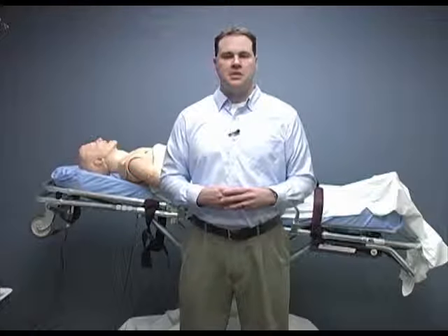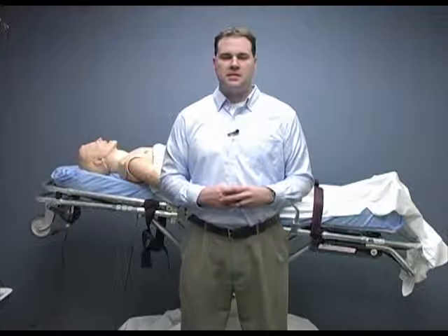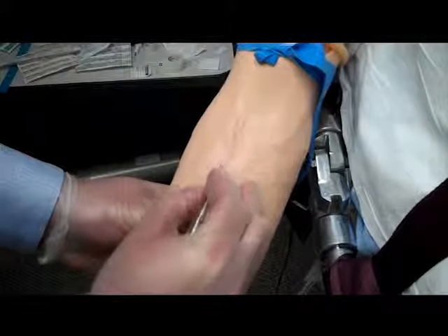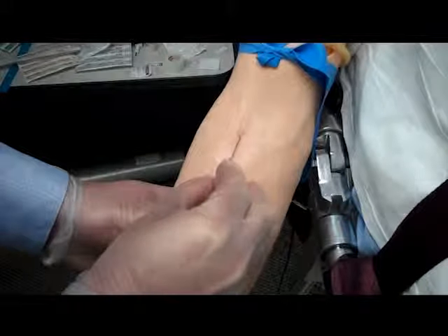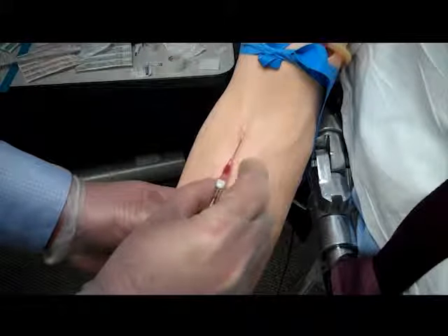We have prepared our patient and equipment. Now it is time to perform the actual venipuncture. You want to pull the skin around the puncture site taut with your non-dominant hand. Grasp the IV catheter by the body with your thumb and middle finger. Your index finger rests on the hub of the catheter. You want to make sure the bevel is up and you are approaching the site at a 10 to 30 degree angle. Insert the needle until you feel a pop and see blood flash in the flash chamber.